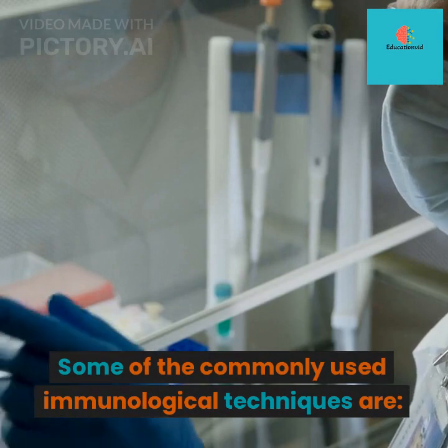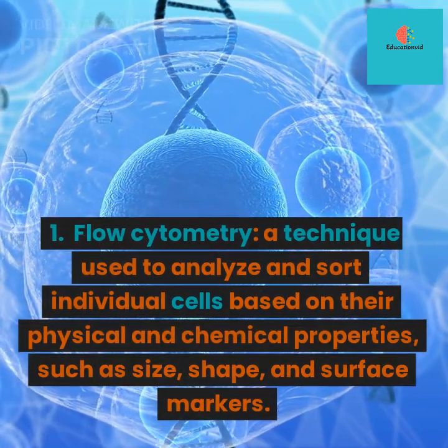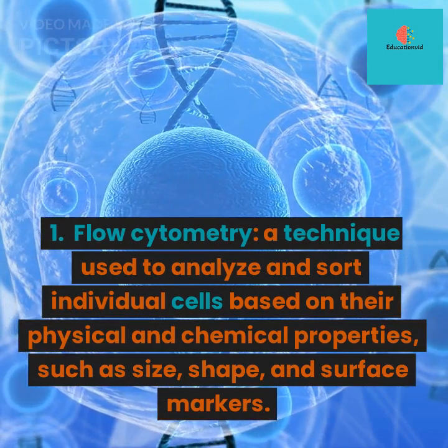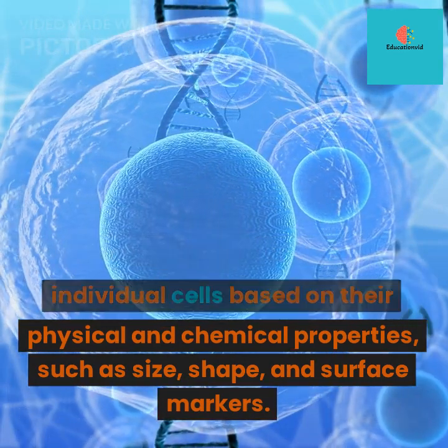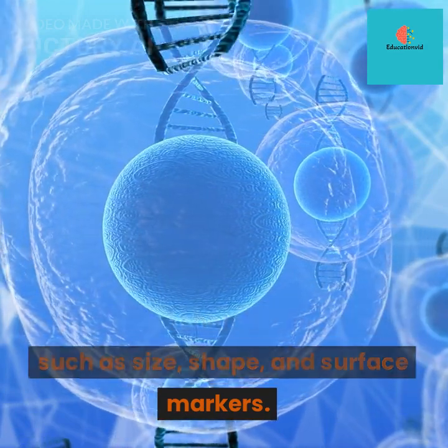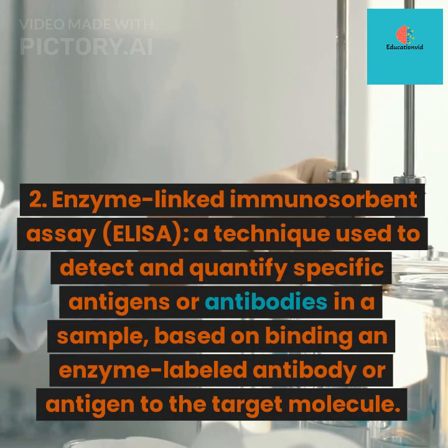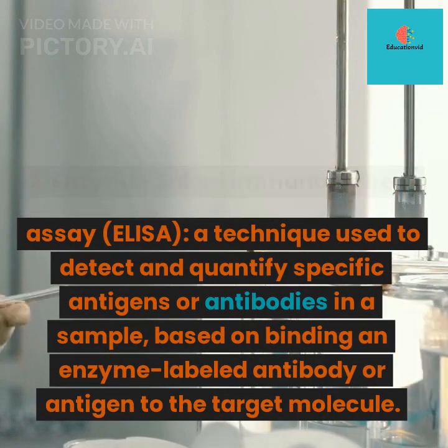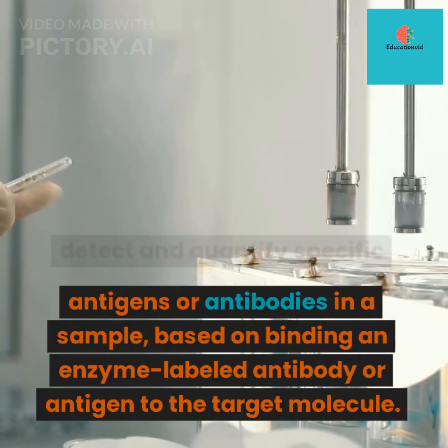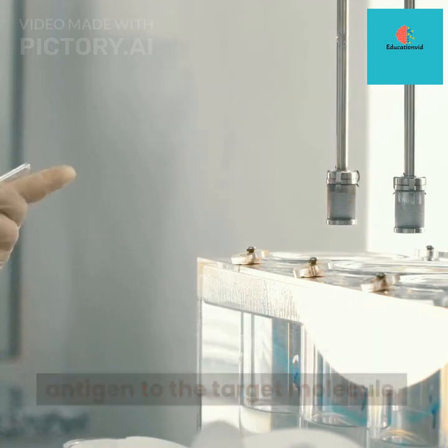Some of the commonly used immunological techniques are: 1. Flow cytometry, a technique used to analyze and sort individual cells based on their physical and chemical properties, such as size, shape, and surface markers. 2. Enzyme-linked immunosorbent assay, ELISA, a technique used to detect and quantify specific antigens or antibodies in a sample, based on binding an enzyme-labeled antibody or antigen to the target molecule.